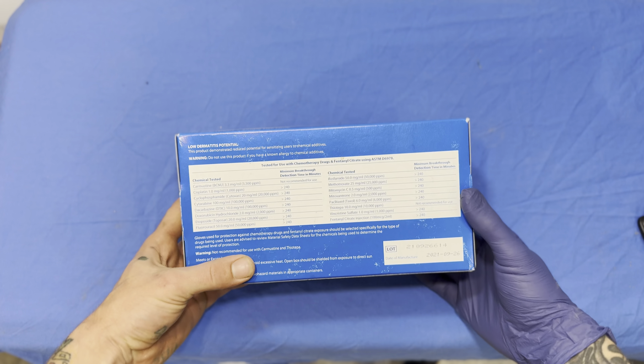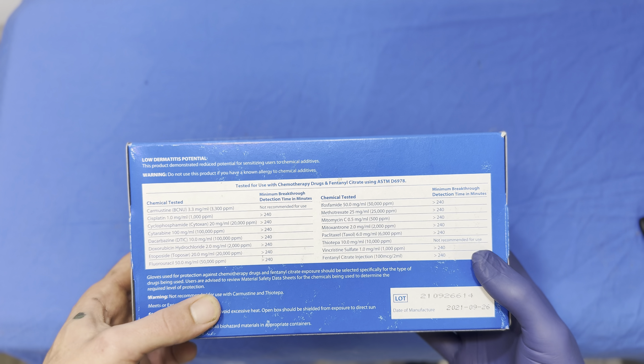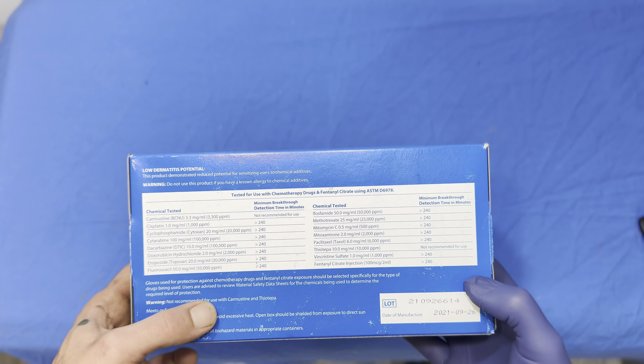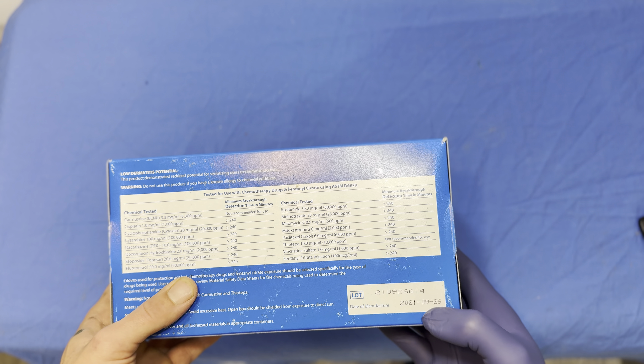This is a really big box — 250 count. We've got our chemical testing right there: it says it is tested for use with chemotherapy drugs and fentanyl. And you've got your date of manufacture right there as well.